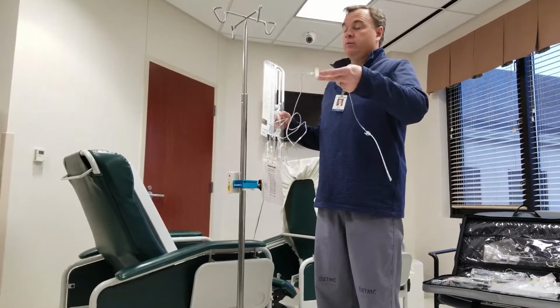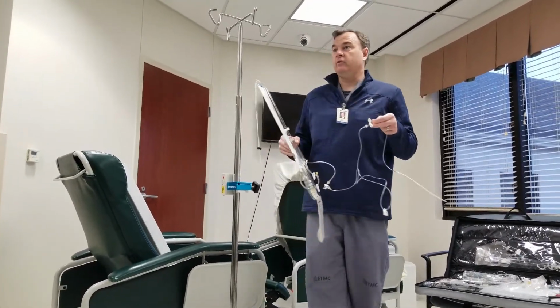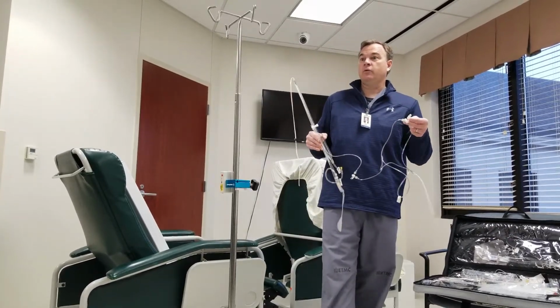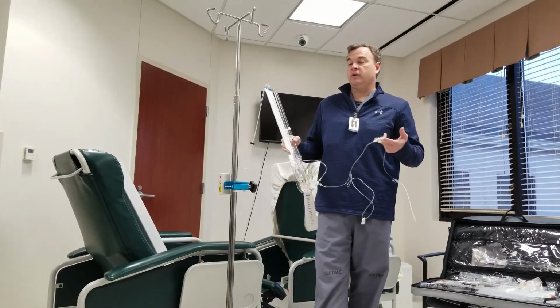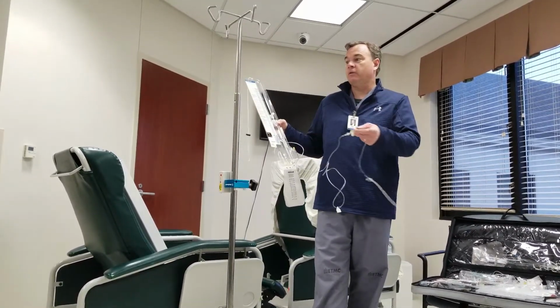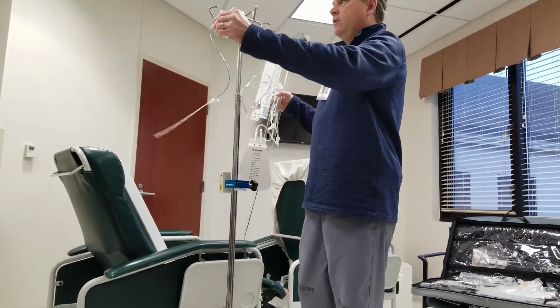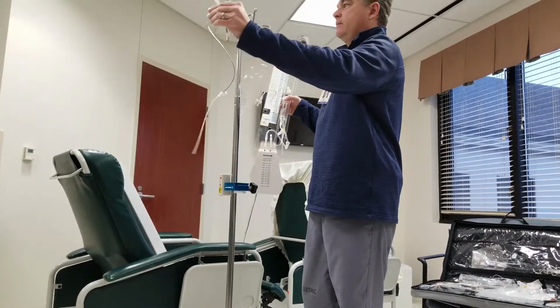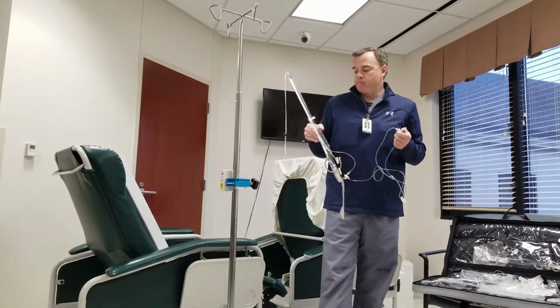Once in a blue moon, you see how it happens when there's a bird's nest of IV tubing and the buzzers are going on, you've got to get to another room. Typically it's more of a ventricular drain thing they're concerned with because it's at the head and there's a bunch of tubing. But just be aware that this blue line is meant to look weird and jump out at you. We're never pushing meds down through that.